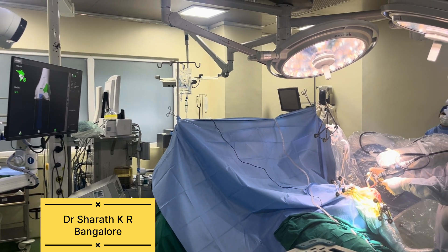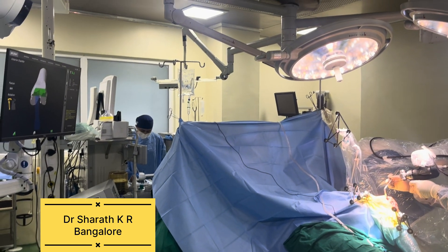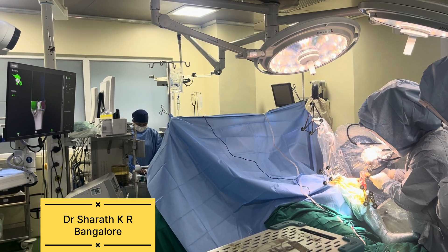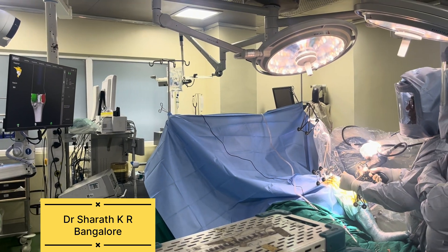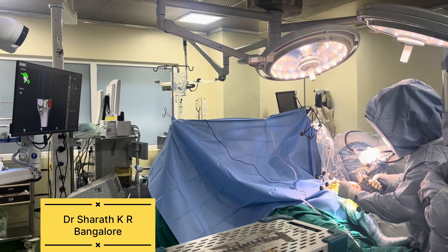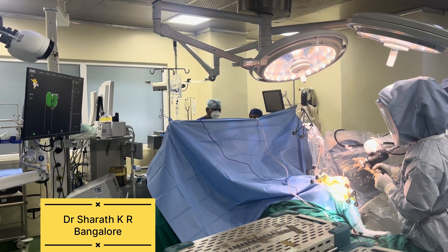You can see that there are different cuts in the bone — here we are doing bone resection, that is bone cuts. There will be a green colored area which after resection will be removed, and then a white colored area is formed. Once it turns white, that means whatever area was to be removed has been removed. If there is a red color on the monitor, it means up to one millimeter of extra bone has been removed. The cuts include distal femur, anterior femur, posterior femur, anterior and posterior chamfer, and proximal tibia resection — these are all the resections required to perform total knee replacement in order to place the implants in the bone on the knee joint.